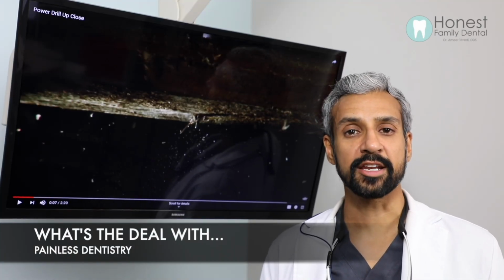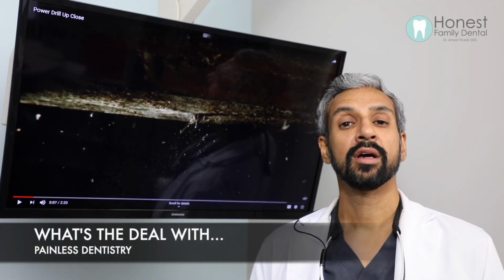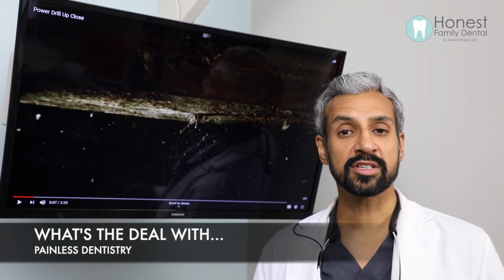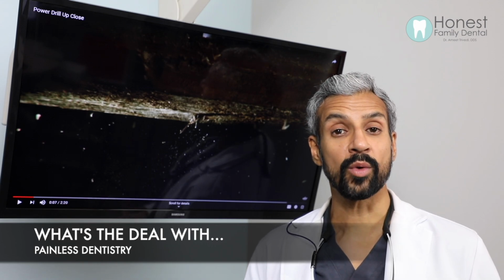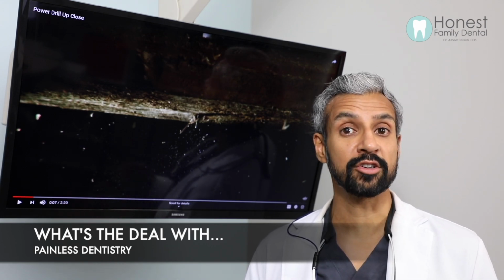What's the deal with painless dentistry? Is that even achievable? First, we have to understand what causes pain. The most common procedure that causes pain in dentistry is fillings. And the traditional way of doing fillings is utilizing what's called a dental drill.